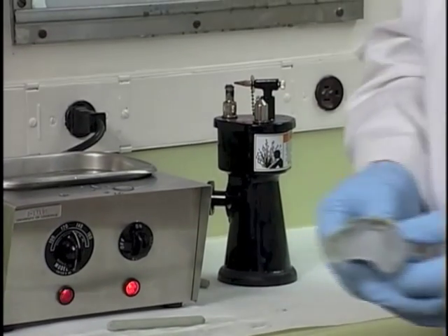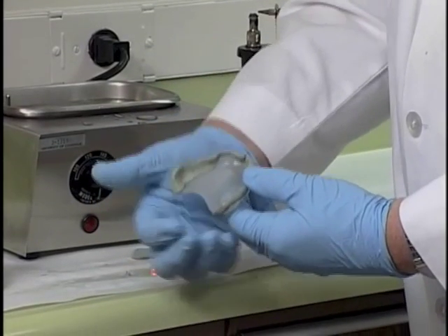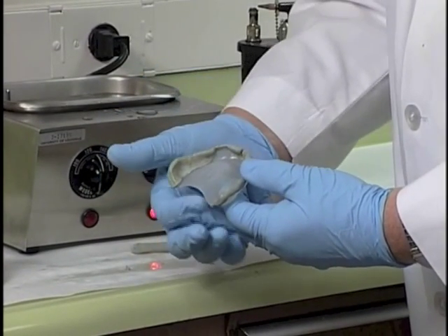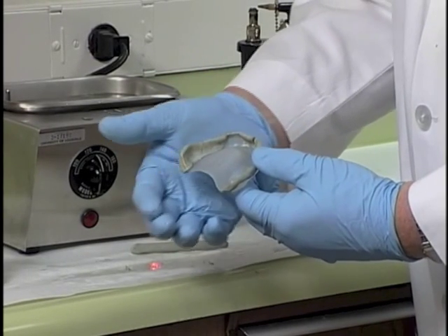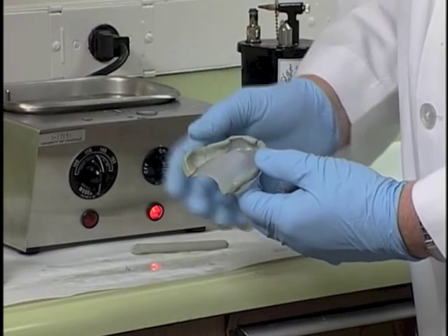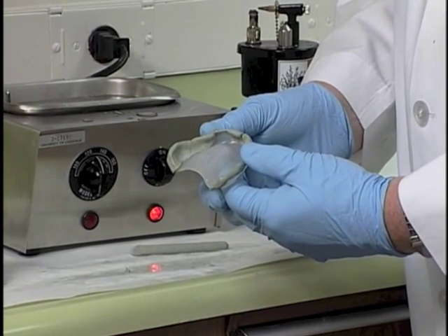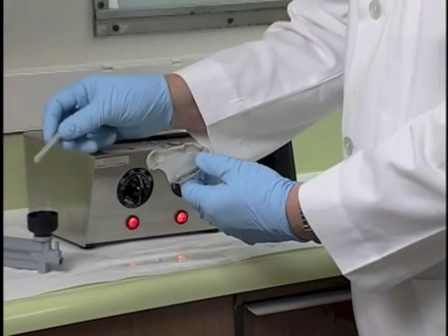The fourth section where we need to apply compound is across the posterior part from hamular notch to hamular notch. In this application, however, we do not want to lengthen the tray as far as its length is concerned. We want to place the material on top of the tray so that when this material is placed in the patient's mouth, it will displace some tissue. So we just add the compound.